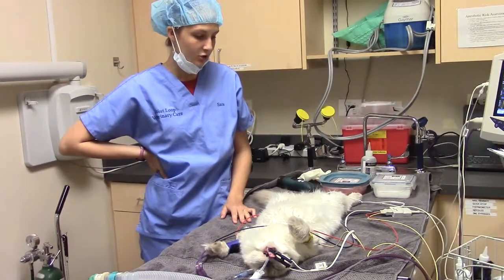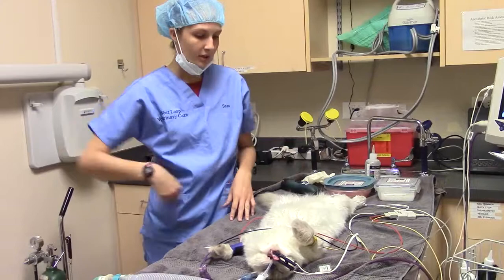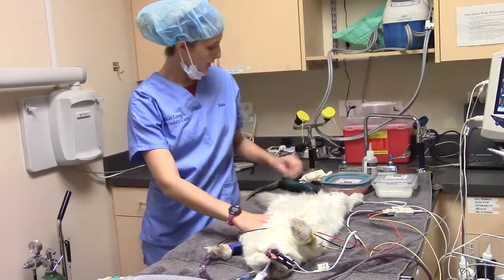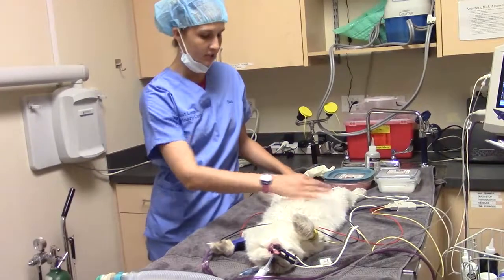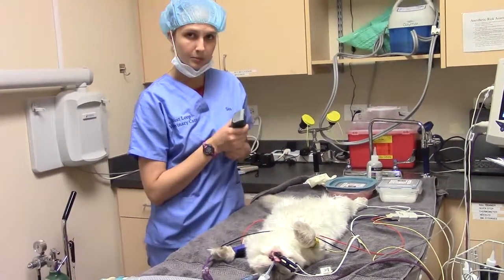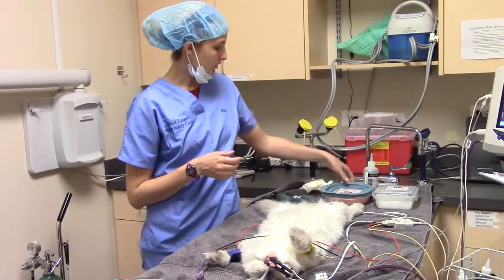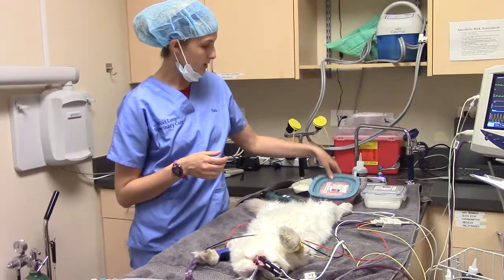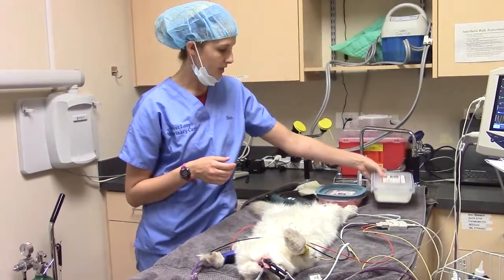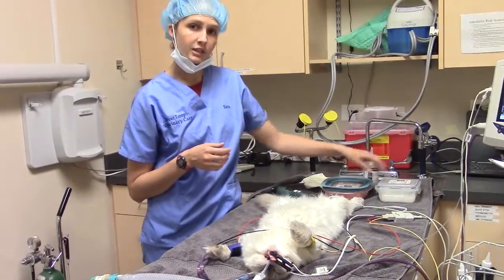When we go ahead and shave, before the surgical scrubs, we're going to be shaving from the xiphoid down to the pubis, and we're going to want to go about a clipper's length on each side of the nipples. We've got a number 40 clipper blade, and over here I've got chlorhexidine scrub which is 4%, and then I've also got isopropyl alcohol 70%.